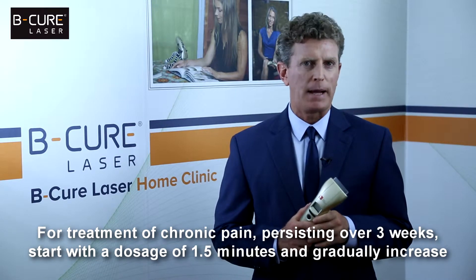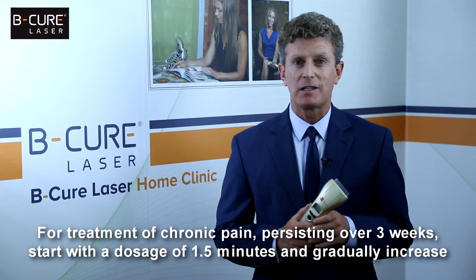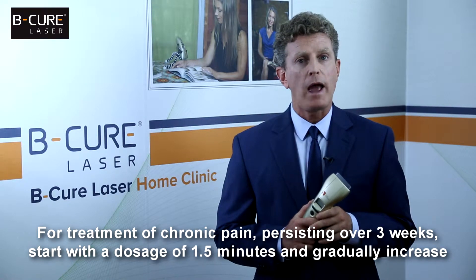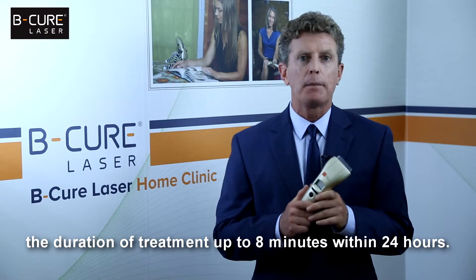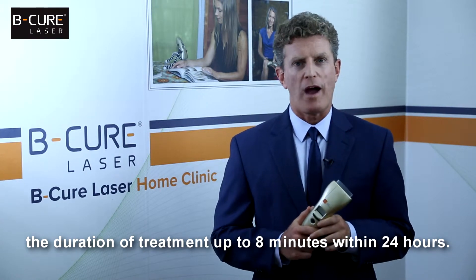For treatment of chronic pain persisting over three weeks, start with a dosage of one and a half minutes and gradually increase the duration of treatment up to eight minutes within 24 hours.